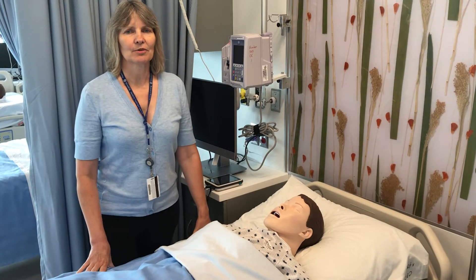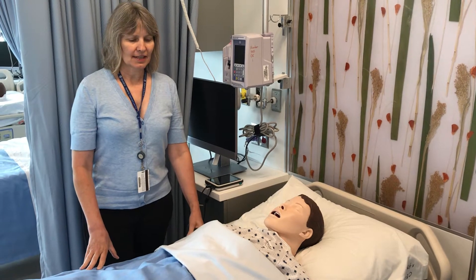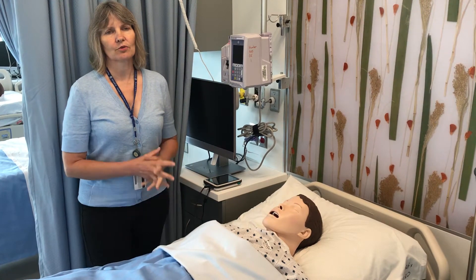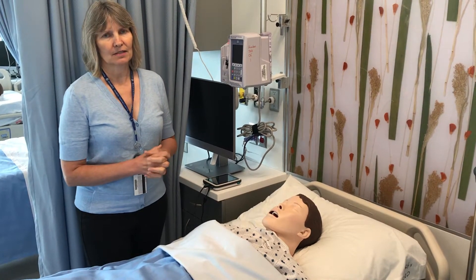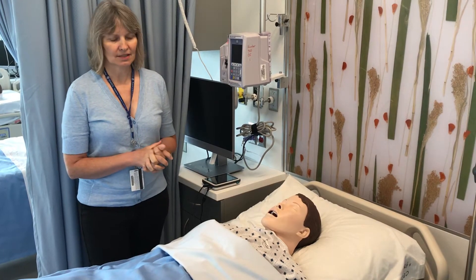Hi, I'm Marilyn Morrison from the CE Program for Nursing here at Humber College, and we're in the new CE lab. I'm going to be showing you how to program the mannequin for some basic functioning to use in class and also for student testing.